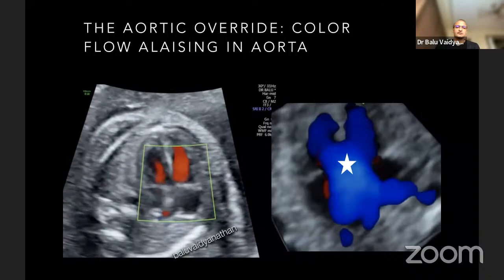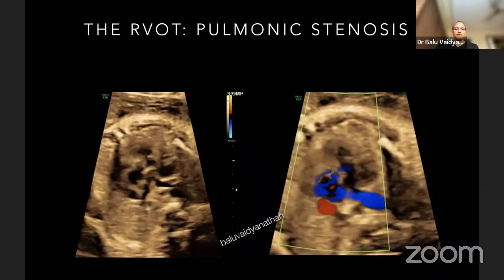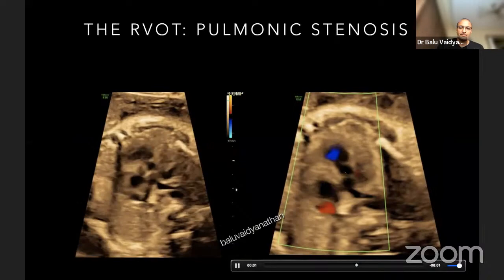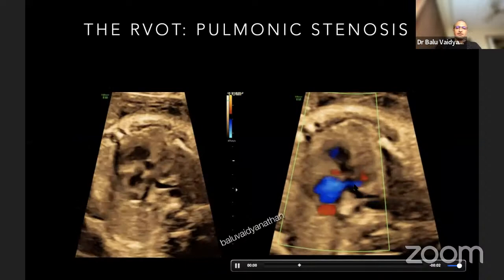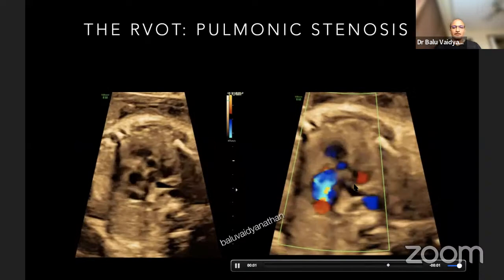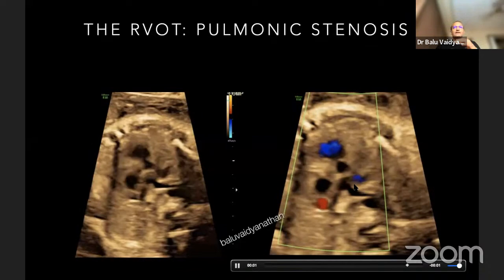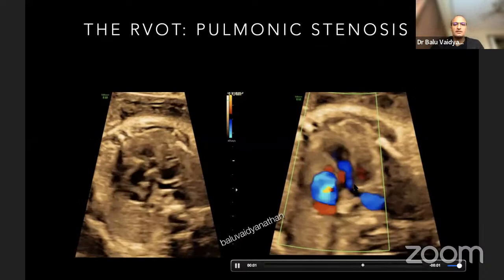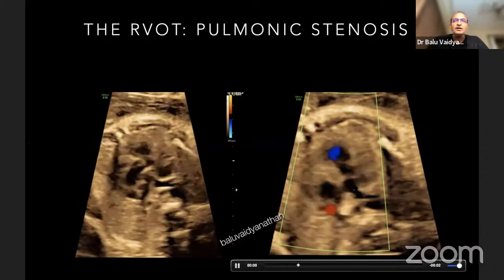Both ventricles are ejecting into the aorta. The aorta will often look very big because it is receiving more blood than normal. When you go to the three vessel view, you see there is forward flow into the PA, but when you compare the size of the aorta and the pulmonary artery, you find the aorta is actually quite big while the pulmonary artery is small. In the three vessel view, there is a discrepant size of the outflows: the larger aorta and the smaller PA. These are the features of tetralogy of Fallot.